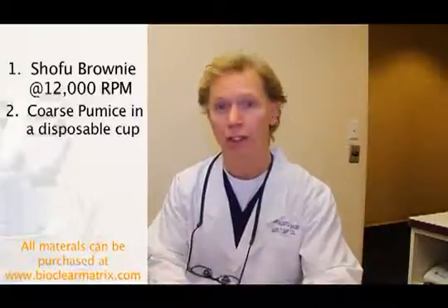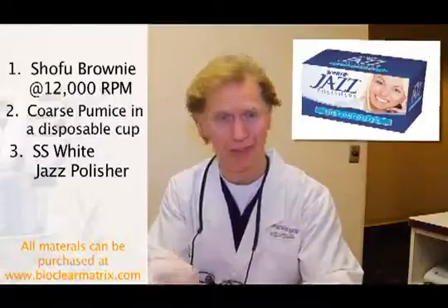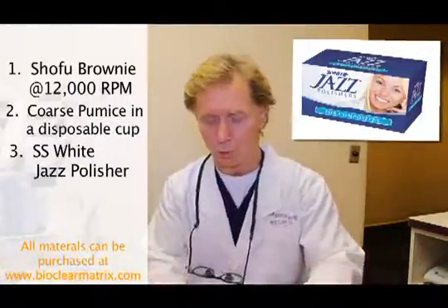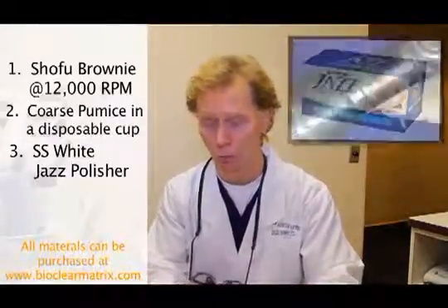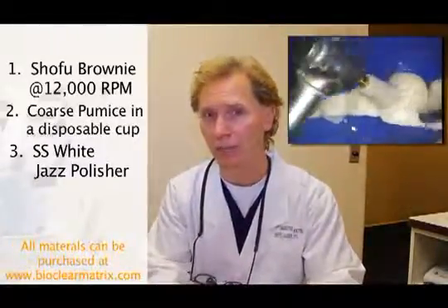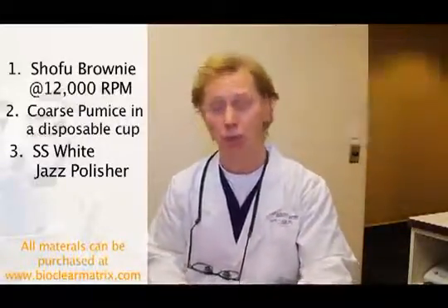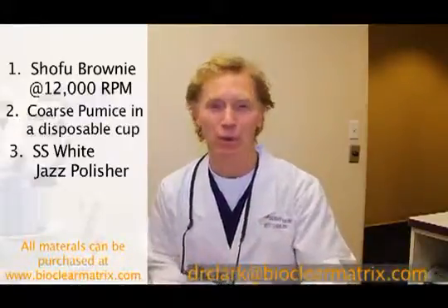Step number 3, the jazz polisher. We spend more time with this. This is diamond impregnated. They're about $10, so make sure that nobody throws these away. We're going to use heavy pressure with this jazz polisher, constant water, and constantly moving the cup so we don't burn a hole with the jazz polisher. You should get a beautiful, moving, living, incredibly smooth finish with the 3 steps.